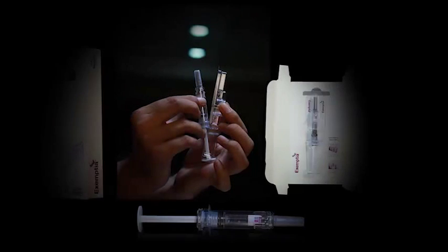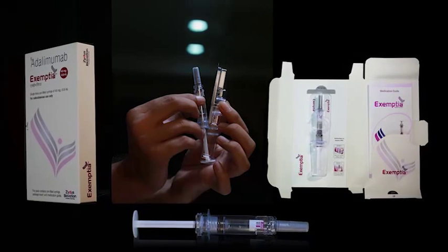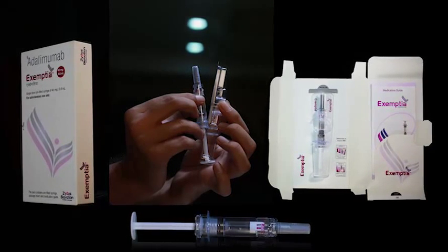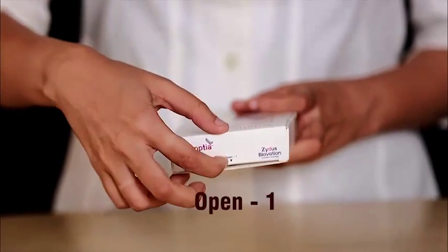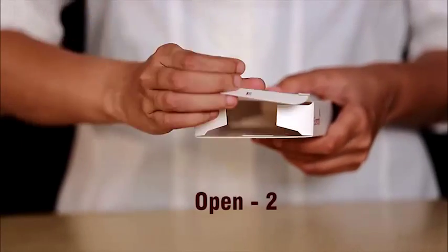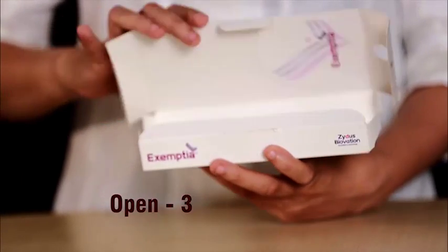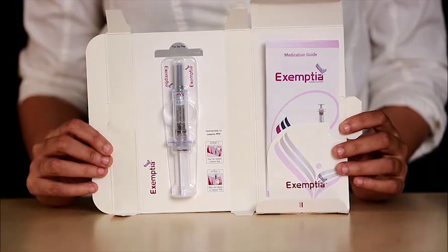This video will demonstrate how Exemptia offers a simple yet effective injecting mechanism. Open the pack from the three areas marked open. The pack consists of the medication guide and a single unit of PFS.